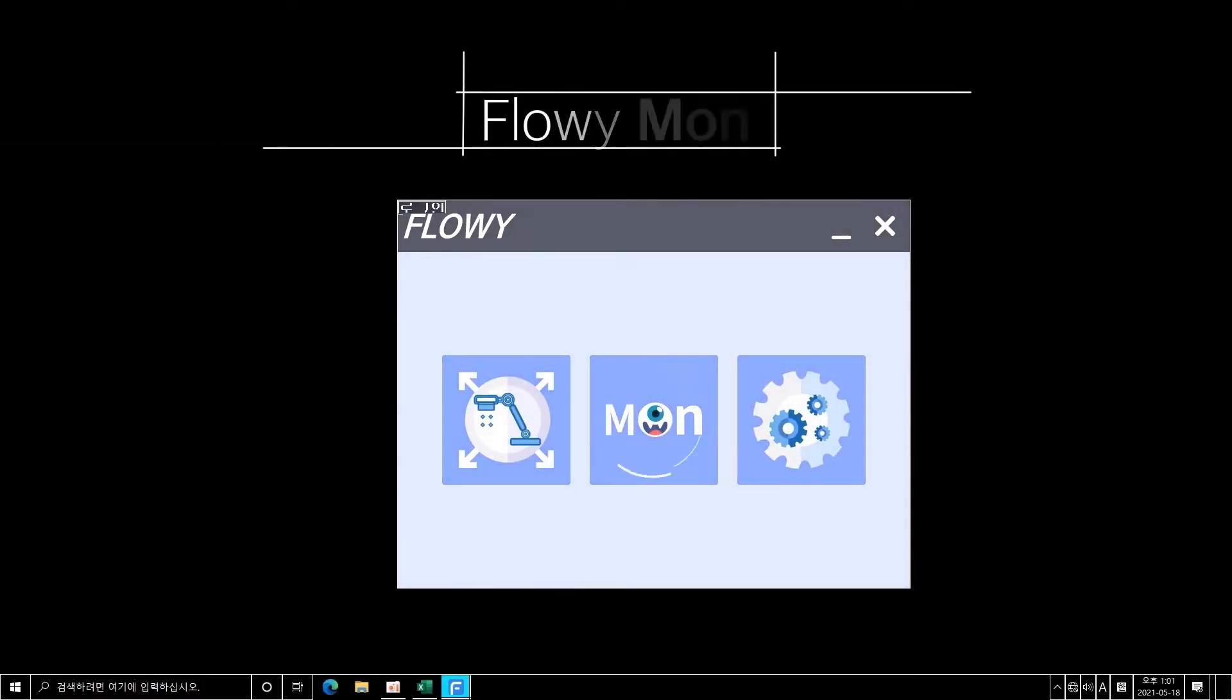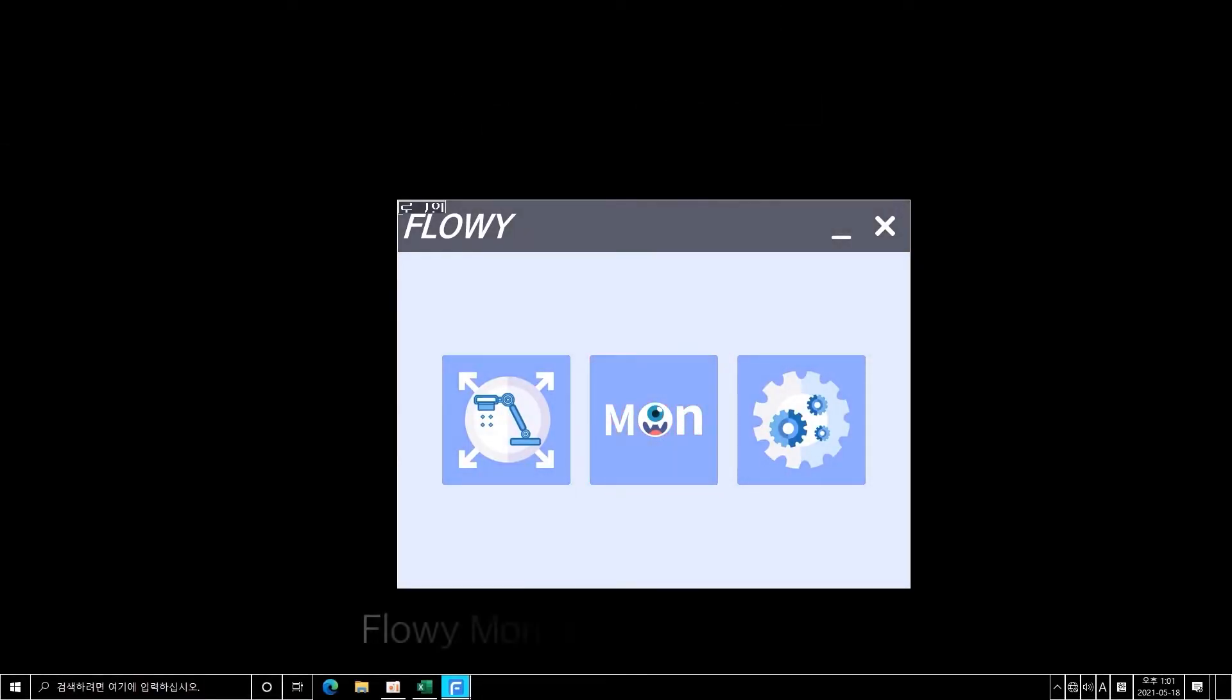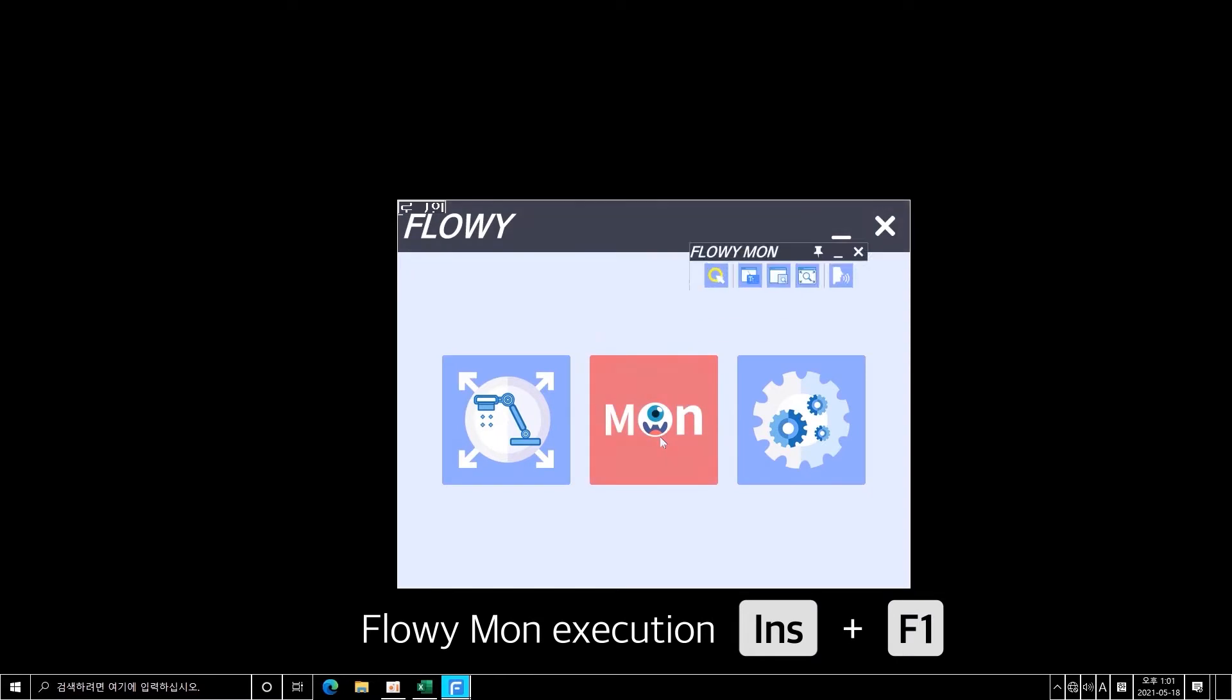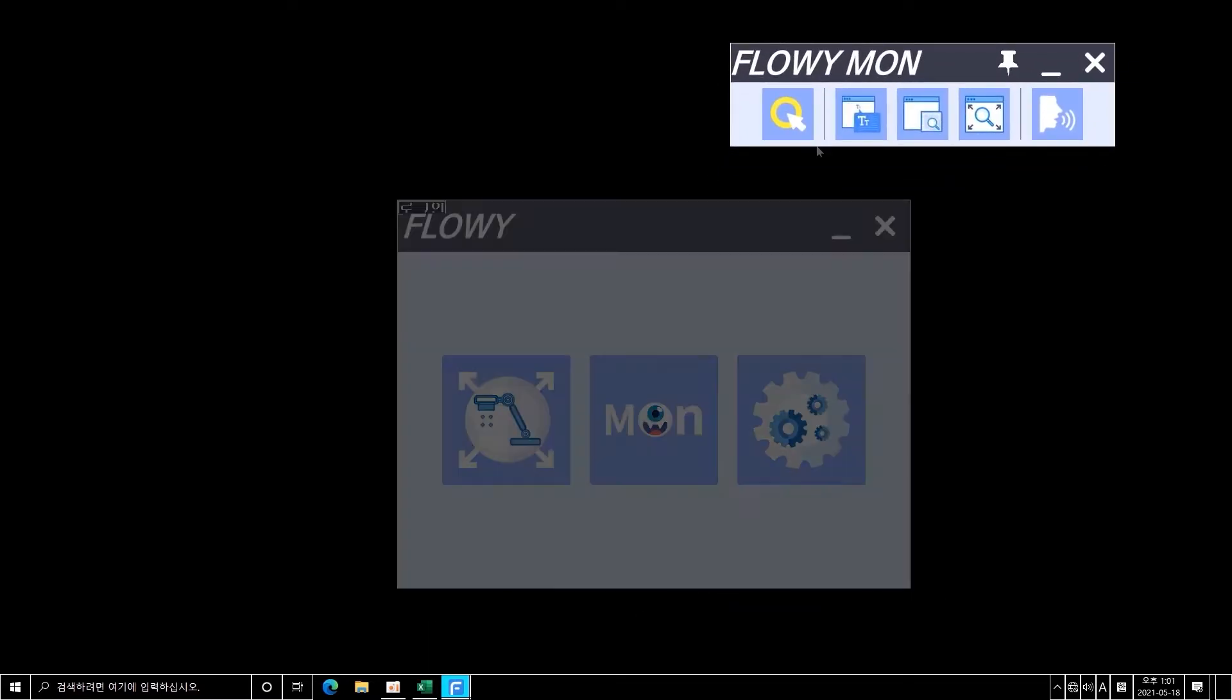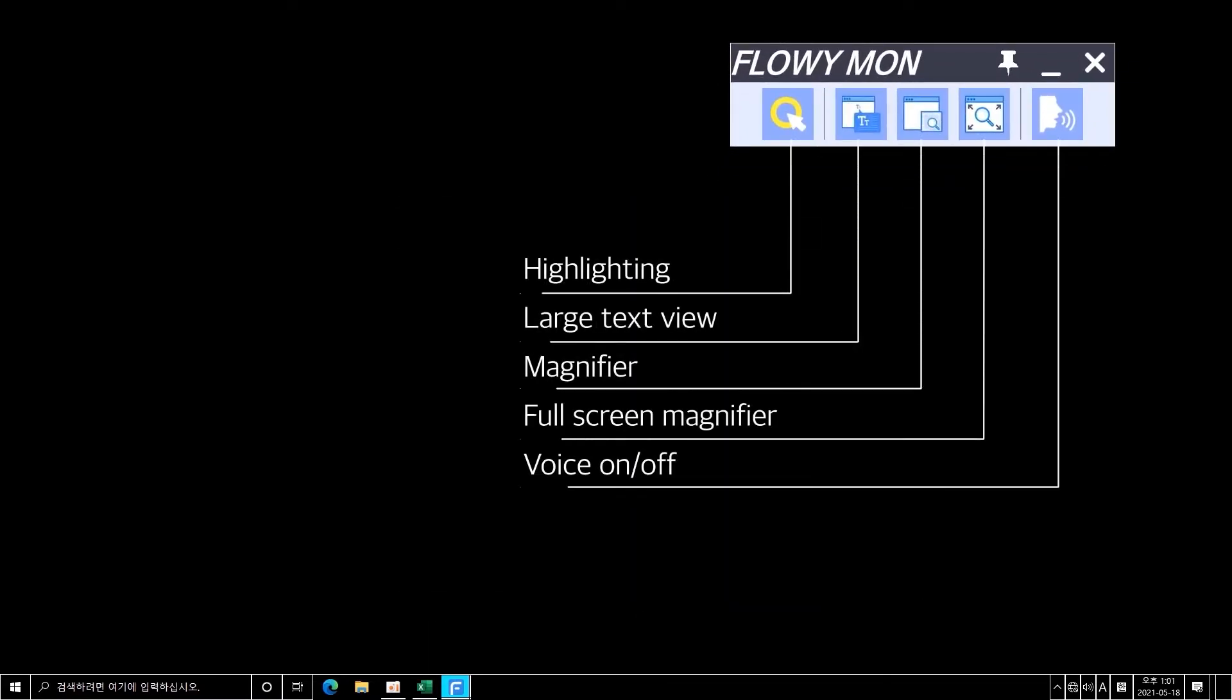Flowymon, the smart screen magnification feature of FlowyEyes, provides a small user interface with various features. From the left, there are highlighting, large text view, magnifier, full screen magnifier, and voice on and off buttons.